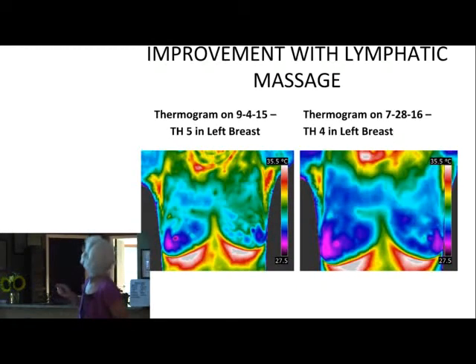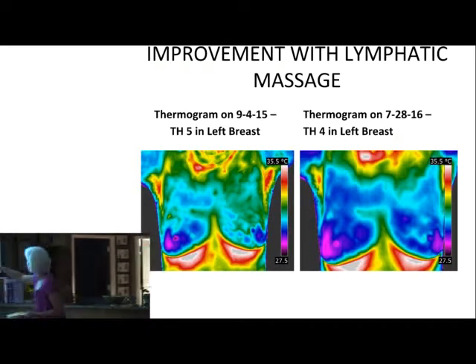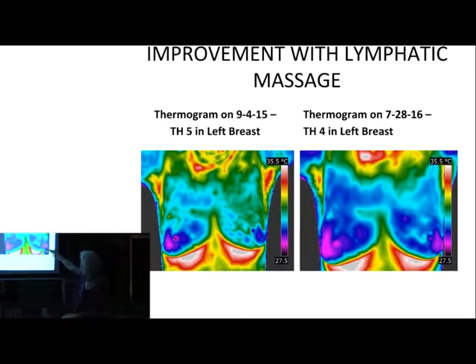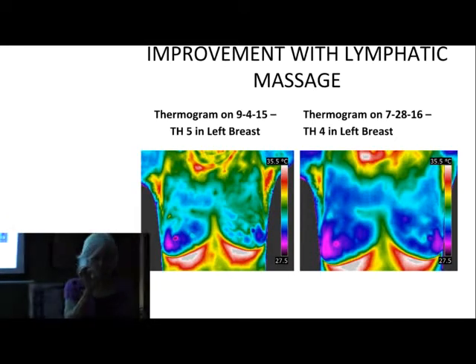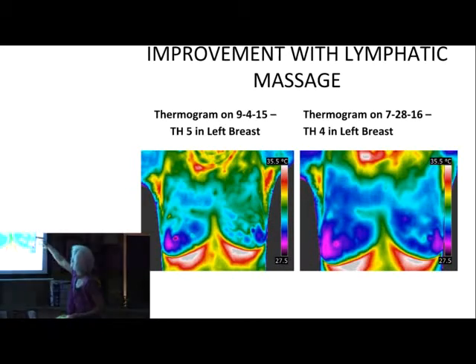Next one, Effie. Okay, and this is very powerful, and this is one of the slides I changed today because this was just done last week on this lady, July 28th, right? This was her thermogram in the fall of last year, and she was assessed 5 in the left breast. You can see the asymmetry there, and if you see the green, let me explain the scale so you know. Black is the coolest color, white is the hottest, and when you go from one color to the next, I told you my camera is sensitive to a tenth of a degree. We're only talking about a tenth of a degree temperature difference in these colors, right?